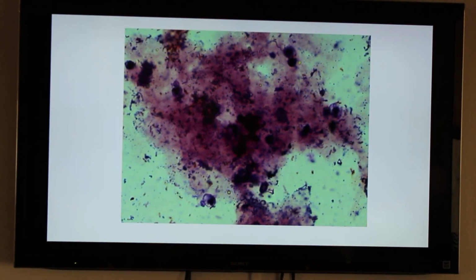So this is a stained sediment using new methylene blue stain. So we have some white blood cells hanging out in here. And then all these little cocci bacteria as well. And then we have some of this, like, maybe it's mucus, it could be stain precipitate. But if you see something like this, then you can definitely compare these tiny bacteria to the big white blood cells.